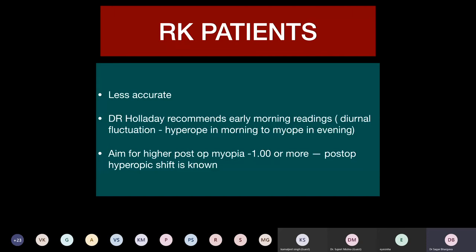So this should be very clear, because the cornea has a lot of multiple peaks. We call it the multifocality of the cornea. And there is a strong demarcation between the steep and the flat area near the pupillary border. So there is a possibility that you might miss that flat area and you might just take a value from the steep area. So there may be a surprise.